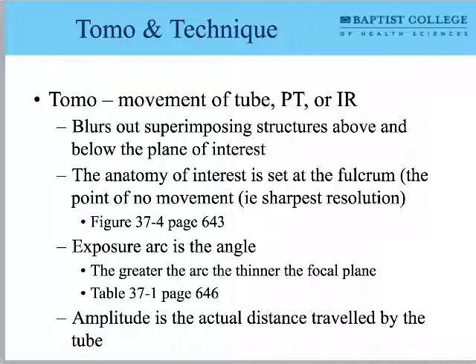Where this is particularly helpful and where we continue to see it quite a bit is in intravenous pyelogram. So we're trying to just see the kidneys. The kidneys are right there in the middle of the abdomen, right? So I'm going to draw a terrible picture of someone's abdomen, in a sagittal view. This is a terrible kidney right here, more towards the patient's back than towards their front, right?